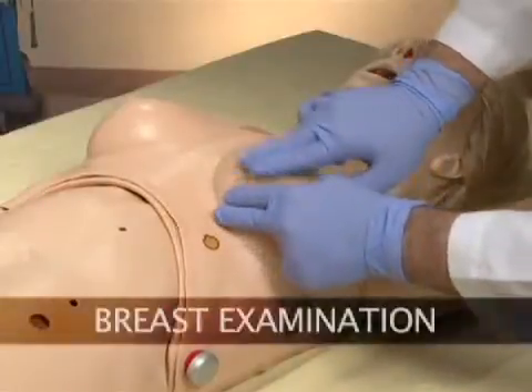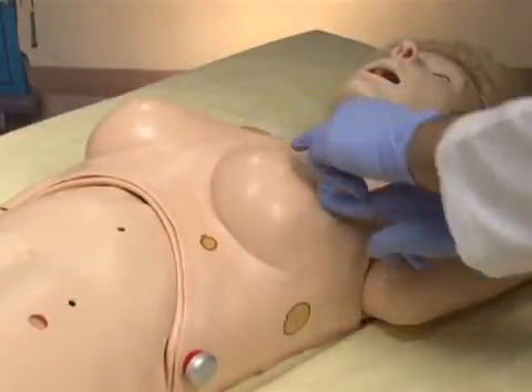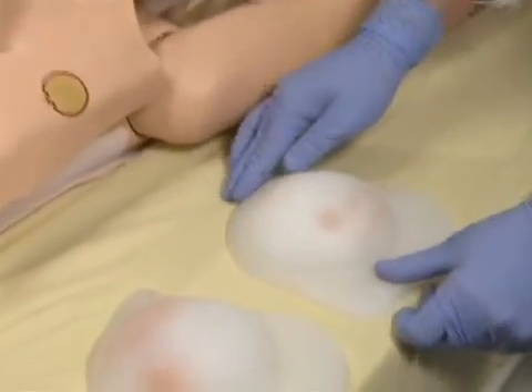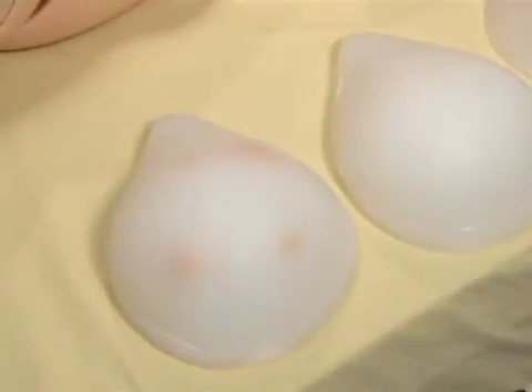SUSI is the first advanced simulator that will give you the capability of doing breast examinations. She's equipped with interchangeable breasts that can demonstrate chronic mastitis, benign growth, carcinoma and the orange skin effect, giant sarcoma, squamous carcinoma, and movement of the mammary gland on the surface of the pectoralis major muscle.